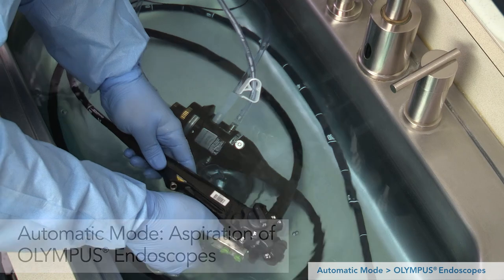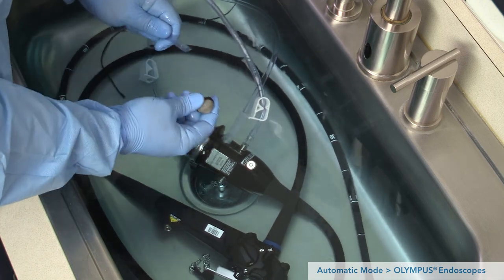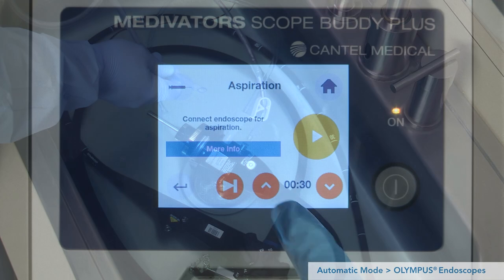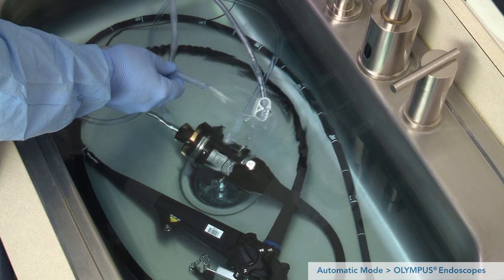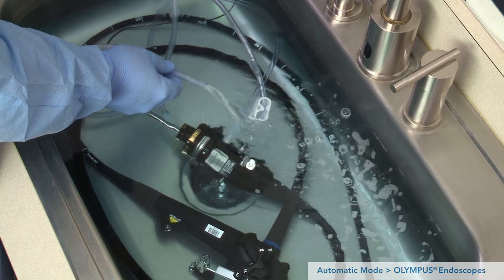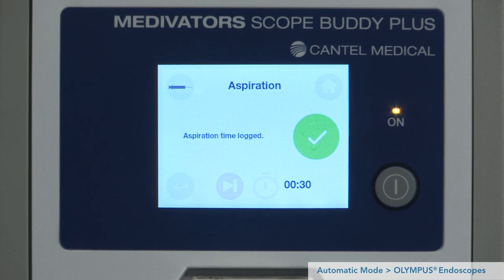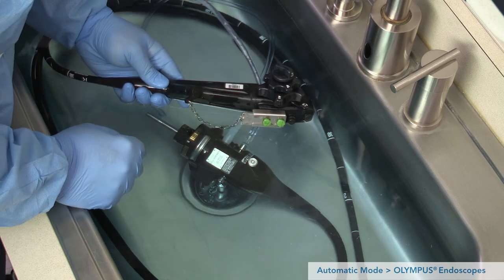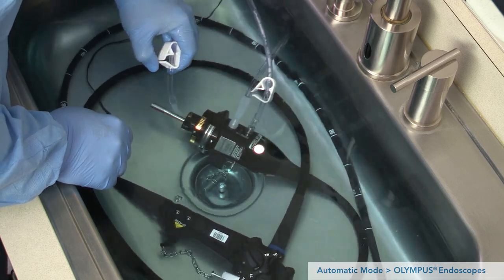To begin the aspiration step, ensure the biopsy cap is off the endoscope's biopsy port. Close all pinch clips on the 24-hour tubing for Olympus endoscopes. Remove the strainer from the end of the pump tube and set aside. Hold the open end of the pump tube over the sink. The default aspiration time is 30 seconds but can be adjusted using the up and down arrows. Press play to begin aspirating. As the pump ramps up, detergent solution should begin to flow out the end of the pump tube. If not, confirm the endoscope is set up correctly for aspiration, press the back button, and repeat the aspiration step. Upon completion of aspiration, replace the strainer on the pump tube, replace the biopsy cap on the endoscope biopsy port, and only release the pinch clips on tubing attached to the endoscope. Leave the pinch clip closed on tubing not connected to an endoscope port.